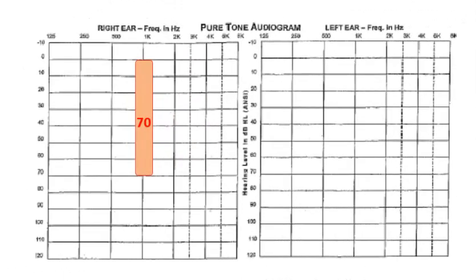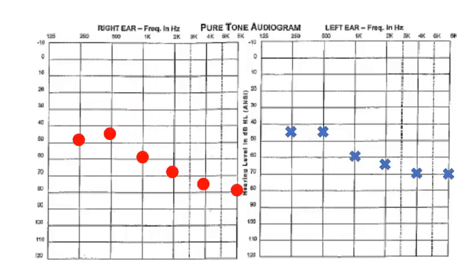Let's again increase the masking noise, this time to 70 dB effective masking level. They won't be able to hear the tone any longer. It will be fully masked in that ear. If we again bring the tone up, this time to 70 dB HL, they'll be able to hear it again 50% of the time. So the effective masking level of masking noise is calibrated in terms of 0 dB HL. They will mask tones that are below the effective masking level, but will not mask tones that are equal to or above the EML. When a signal and an EML are at the same level, the signal will be detected 50% of the time.